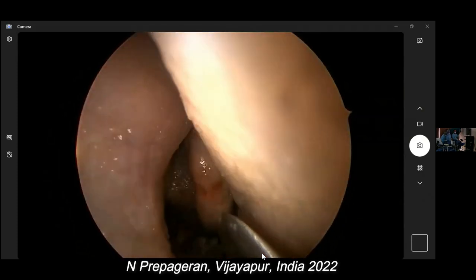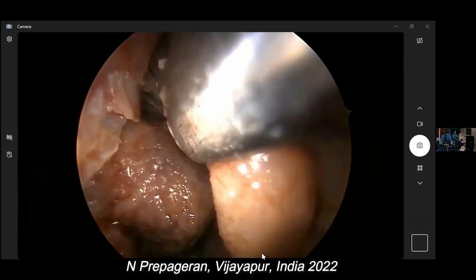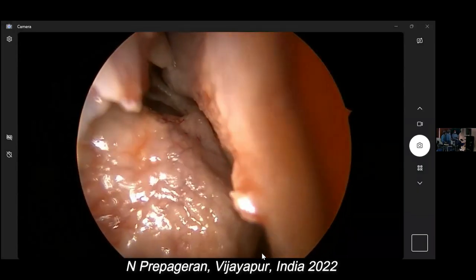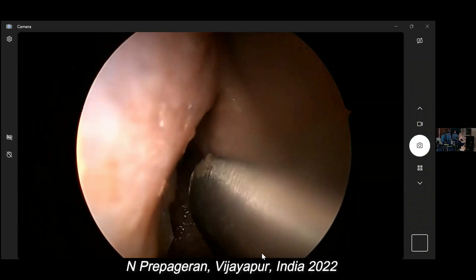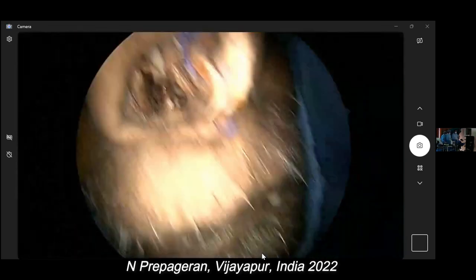So now this is a 0-degree scope on the top of the nose. I'm putting the 0-degree scope on the floor of the nose, and I'm going to look up. You should be able to see the frontal recess up there. Yes, we can see it, just by using a simple 0-degree scope, putting it on the floor. I told you I was a lazy surgeon, right?